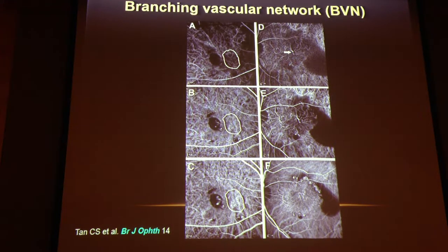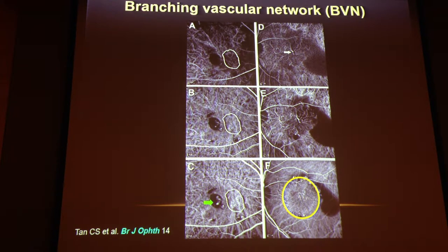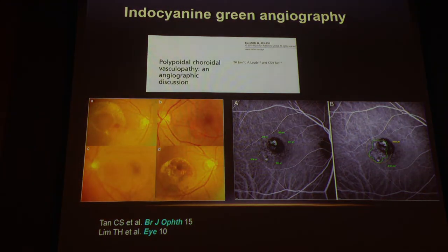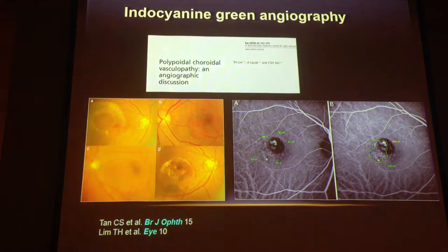Besides the polyps, it's also important when we look at PCV to consider the branching vascular network, or BVN, that supplies it. It's illustrated nicely where there's a feeder vessel that originates centrally, and flow radiates peripherally to supply the polyps in the BVN network.